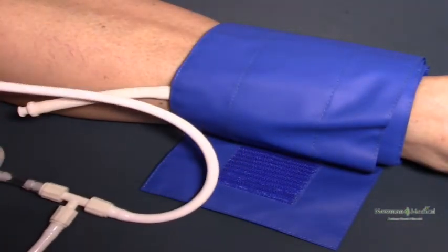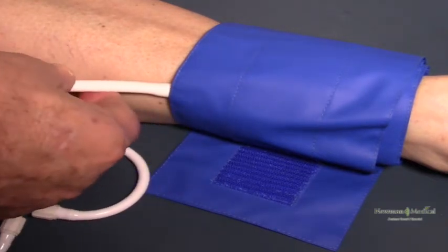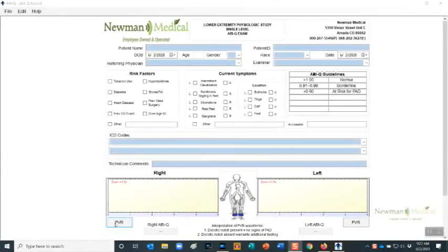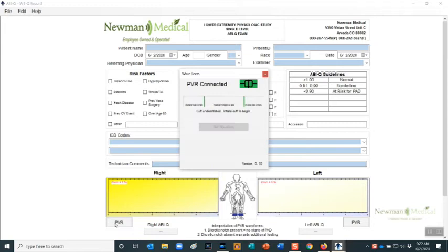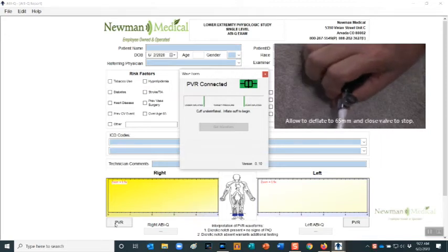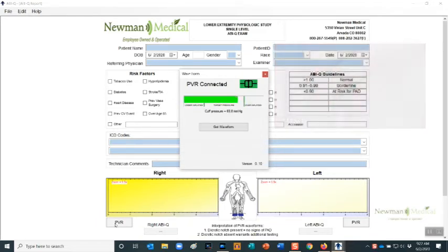Attach the hose to the right cuff as shown. To obtain a PVR waveform, click on the right PVR button in the middle of the screen. Tighten the thumb valve and pump the bulb to roughly 80 millimeters of mercury, then slowly deflate to roughly 65 millimeters and stop.